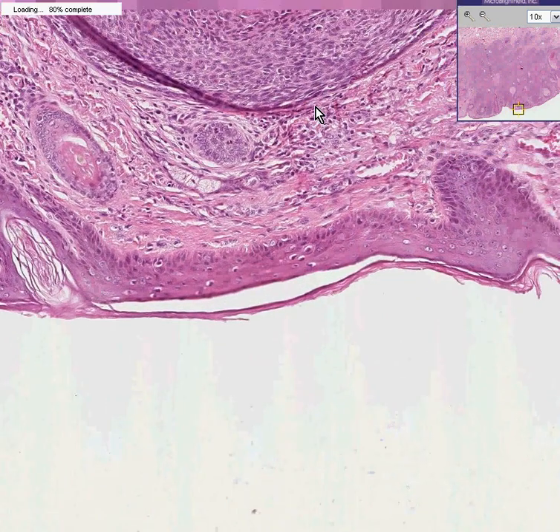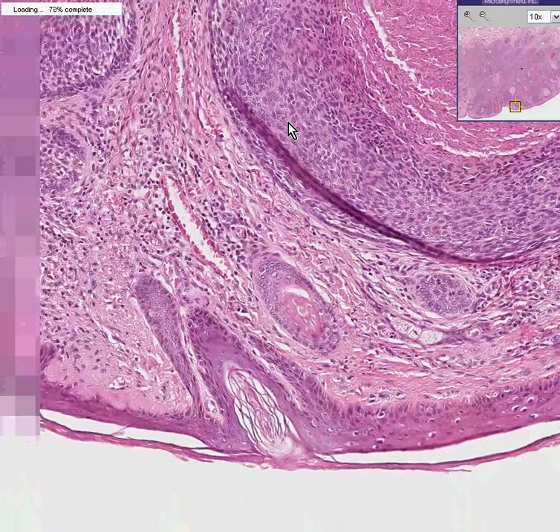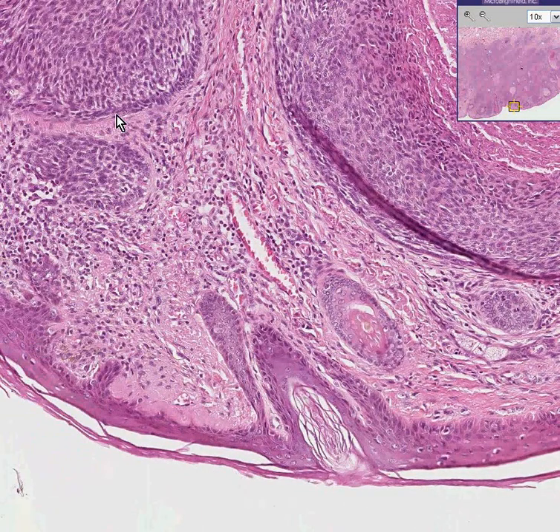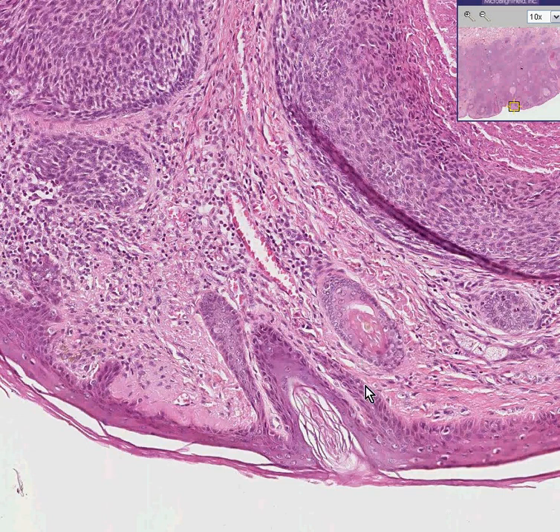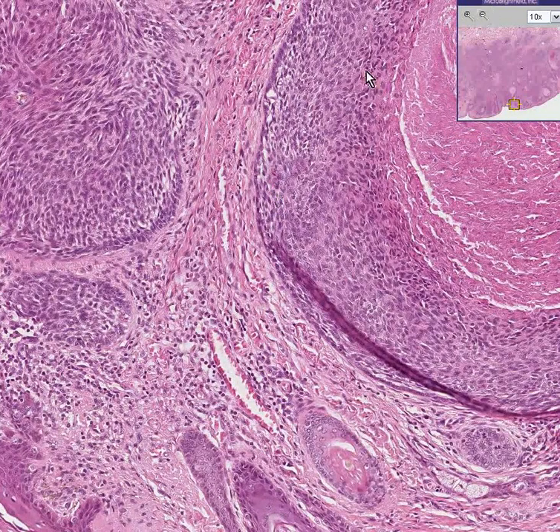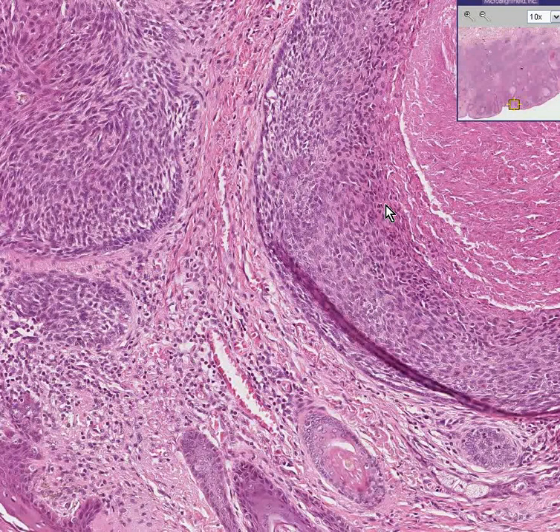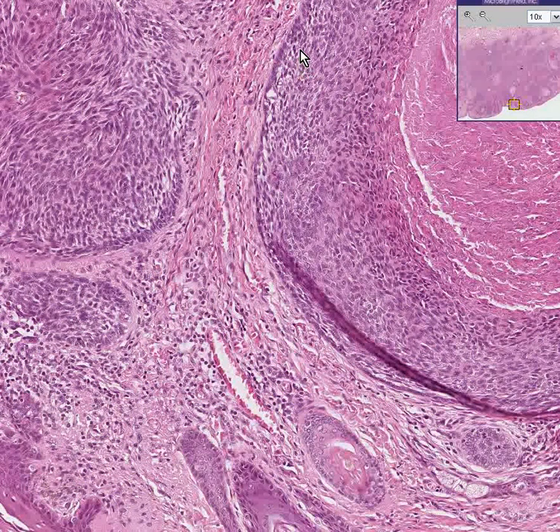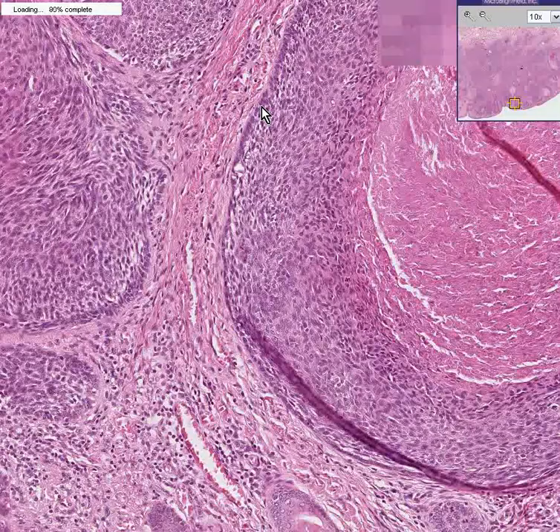Look at all these tumor nests. Do you notice that in the tumor nests there's that same palisading appearance — there, and there, and there. The basal cells of normal skin palisade, and that's why this is a basal cell carcinoma. Whether these are in balls, big balls, little balls, hot dog-shaped things, or sclerotic nests, they generally have palisading at their base.